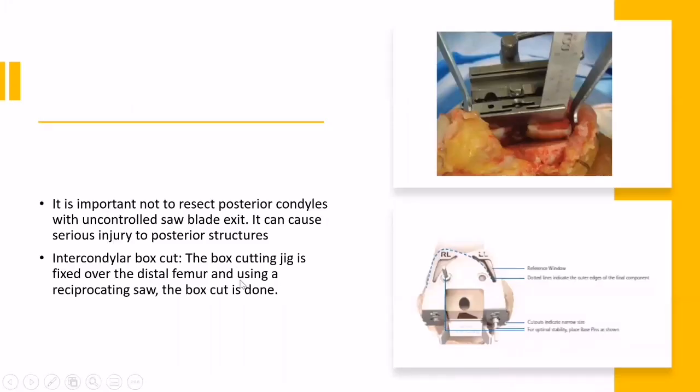to notch the femur. It is important not to resect the posterior condyle without control regarding the posterior condylar resection, with an uncontrolled saw blade exit here we can cause a serious injury of the posterior structures, and there are so many injuries in the popliteal artery or vein.